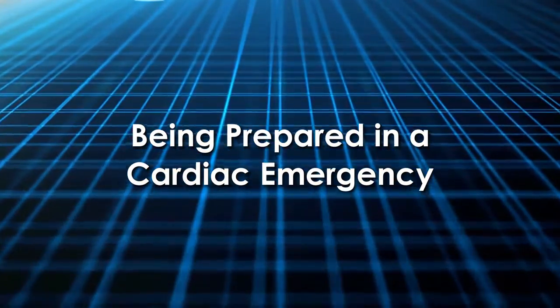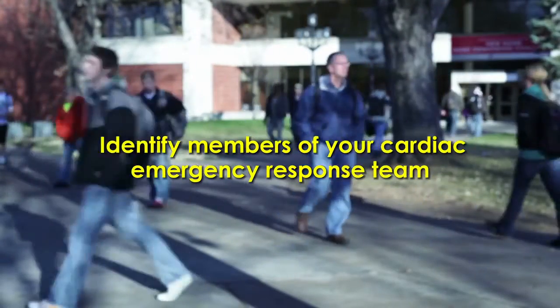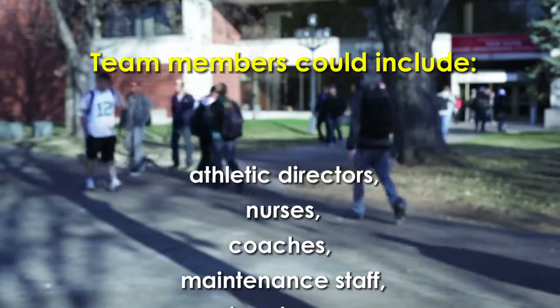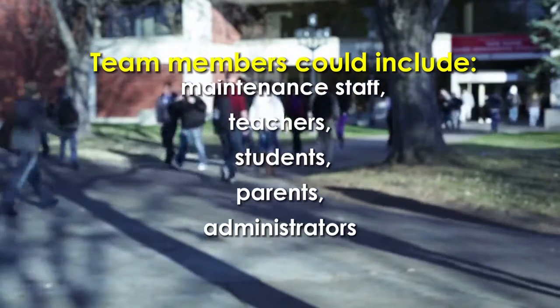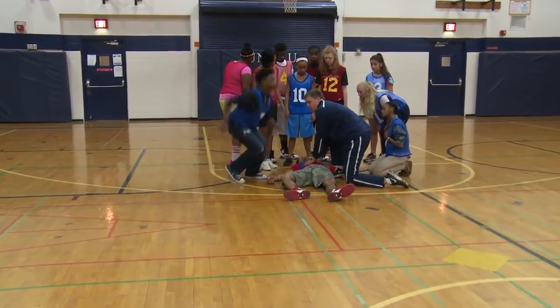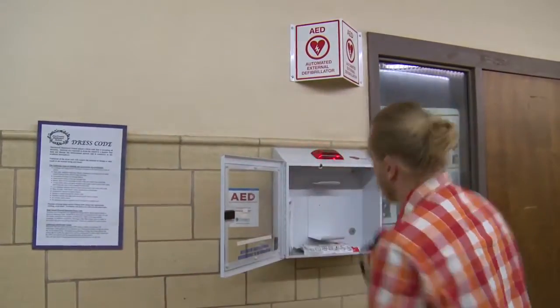To create an effective school CPR AED program, first identify members of your cardiac emergency response team. Team members could include athletic directors, nurses, coaches, maintenance staff, teachers, students, parents, administrators, and other interested individuals who will be fully trained to perform CPR and use the AED. It's important to include team members who are available to support after hours and at off-site events.